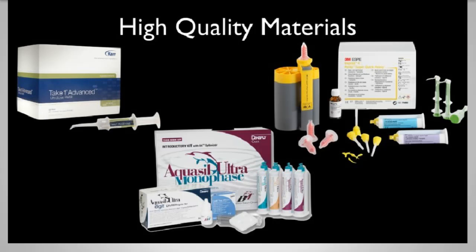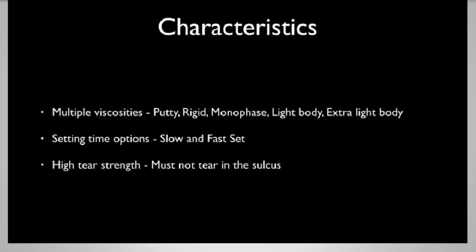You can have very, very nice impressions. But if we mix poor materials with great technique, you can do everything in the world and it may hurt you at the end of the day. So we want to utilize great materials. When I choose an impression material for the office, I like to have a multitude of viscosities. Now this isn't going to cost you any more. Yes, there'll be some more inventory, but whether you pick a rigid material or a light body material, the cost is essentially all the same.